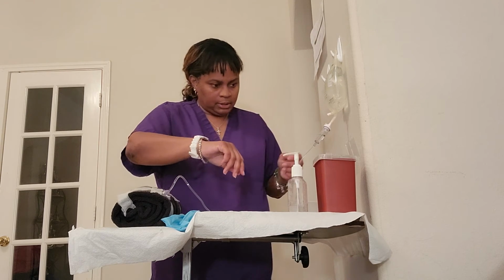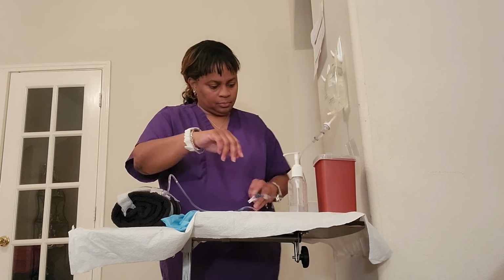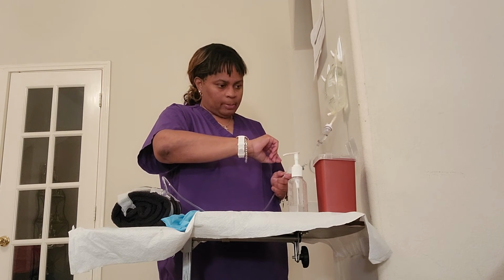Now I'm going to set my rate. Opening my roller clamp and regulate my rate. It's going to be 21 drops per minute.